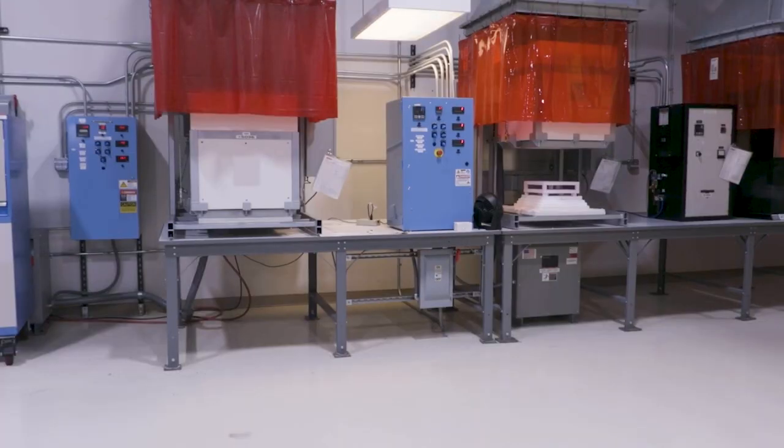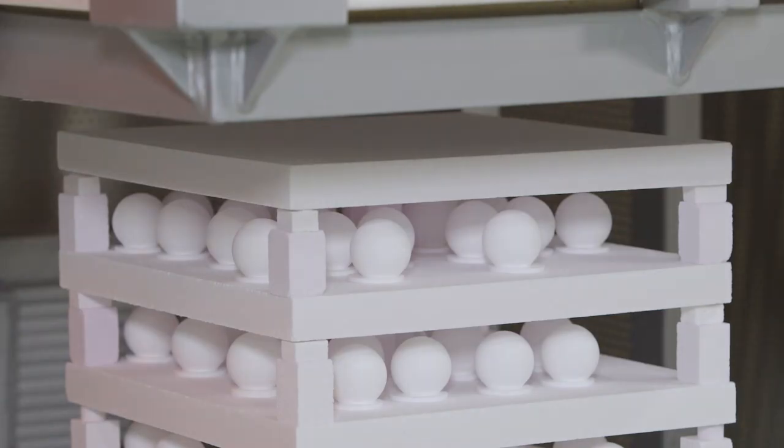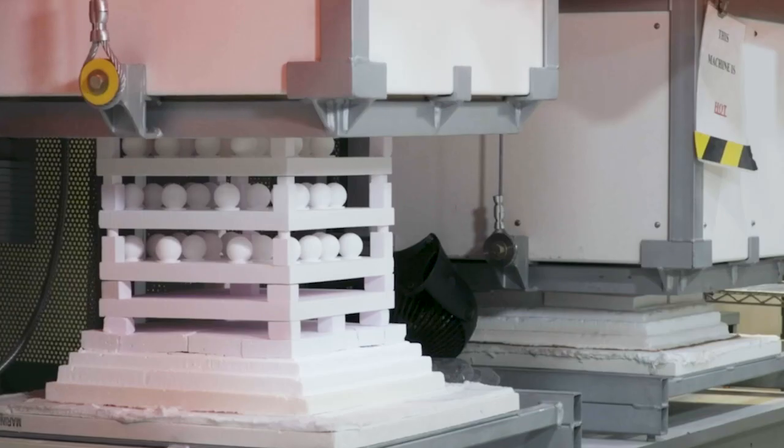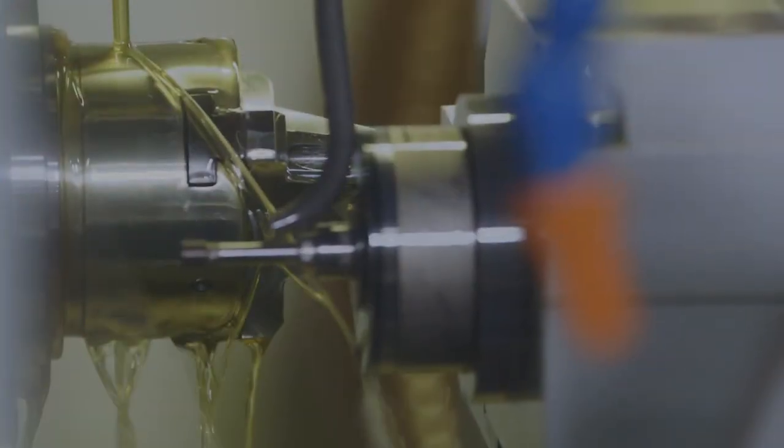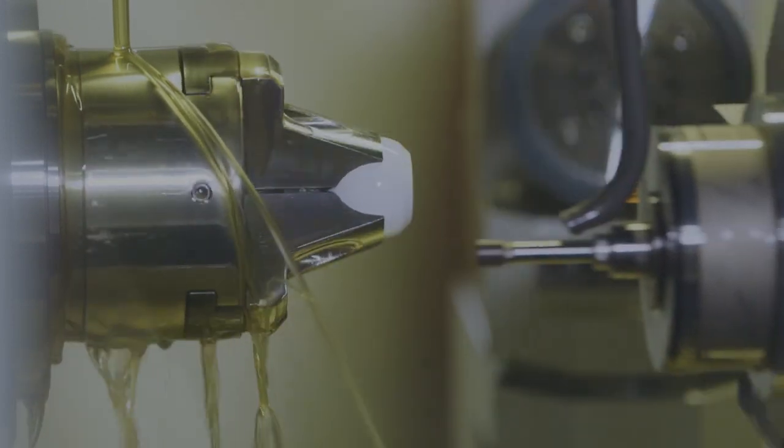Then, the part gets fired in a periodic kiln. Sintering at high temperatures creates a chemical reaction that bonds the grains of powder together, creating one solid piece of ceramic. Precision grinding and polishing creates the final finishes on the component.